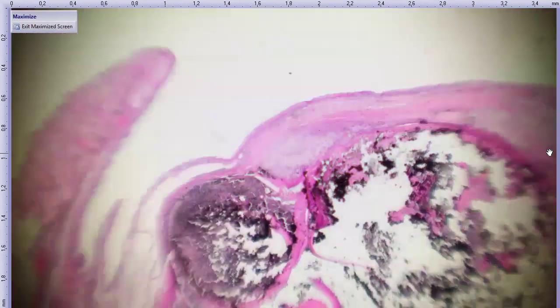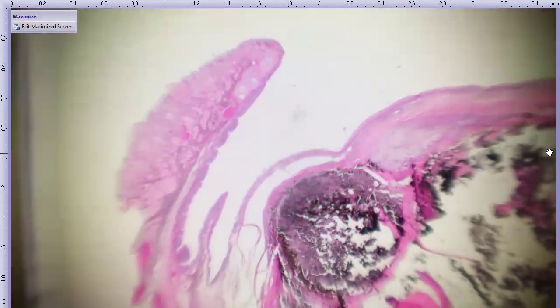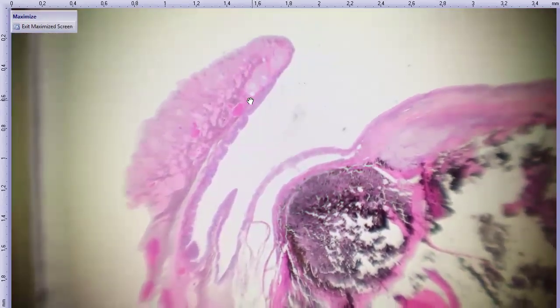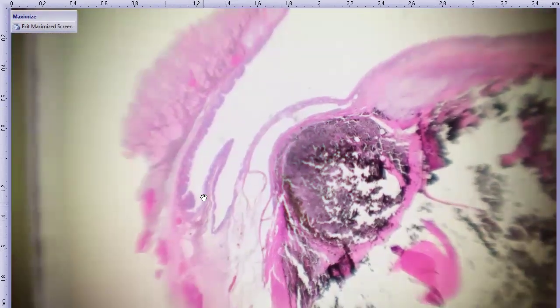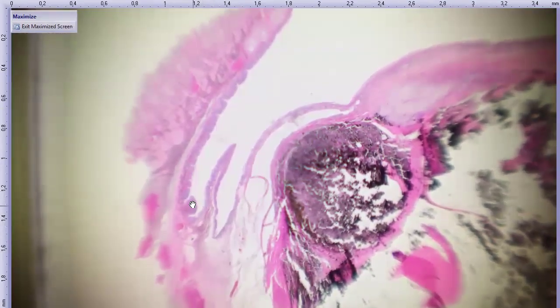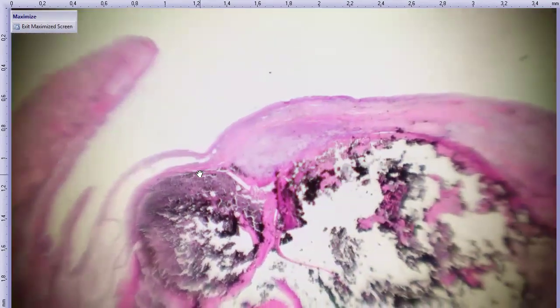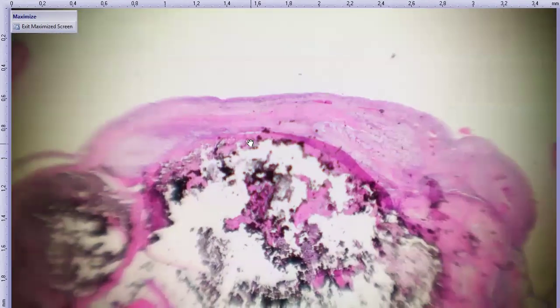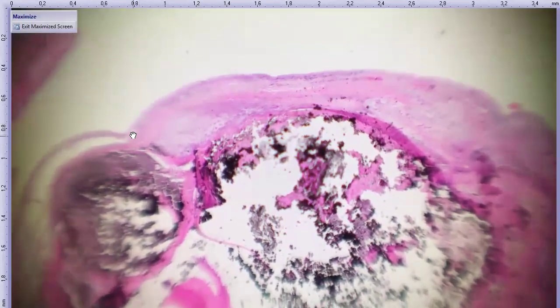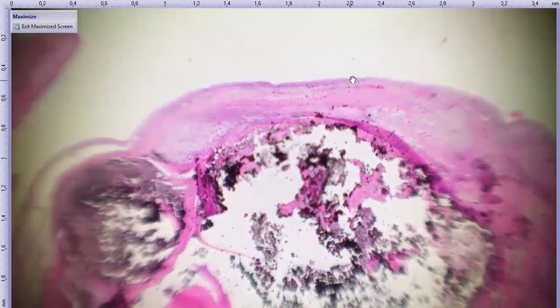Okay, histologically, so here's the subgross appearance of this tumor. It's pretty big, so we'll have to move around a little bit. But nice correlation. We got that eyelid section that we saw, a little bit of the third eyelid coming up right there. So we know that this is ventral. It's easier to start appreciating what was cornea. So here's the corneal surface.